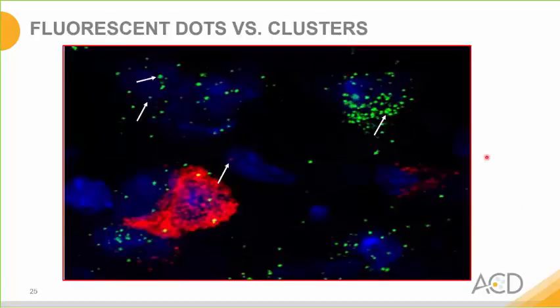Similar patterns of dots and clusters are seen in fluorescent versions of the assay. Again, you can see next to this arrow a likely cluster of green dots relative to a single dot here, representative of a likely single messenger RNA transcript.